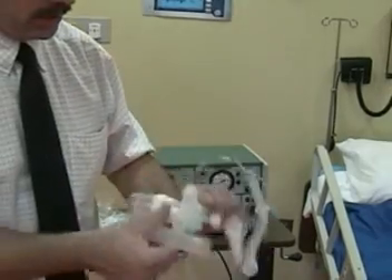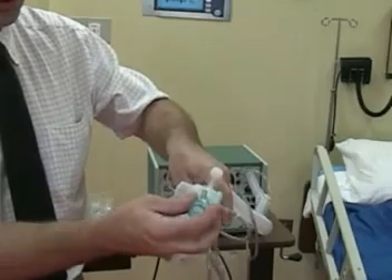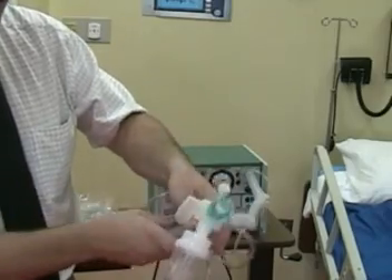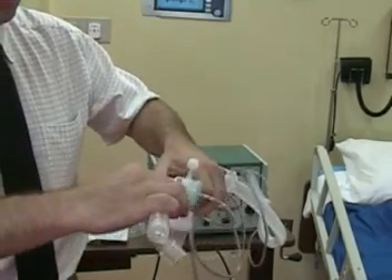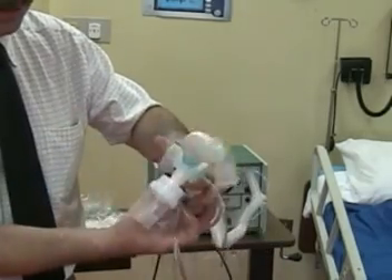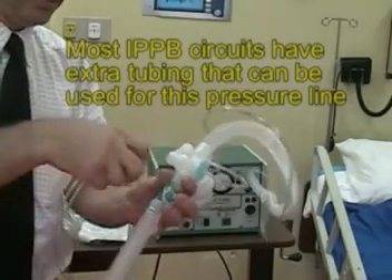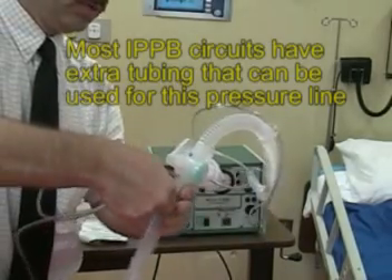The airway connector pressure port is connected next to the exhalation valve. The flex tube is placed back in line, and simple oxygen tubing will act as our pressure line — the port connects to the top of the port and back to the ventilator.